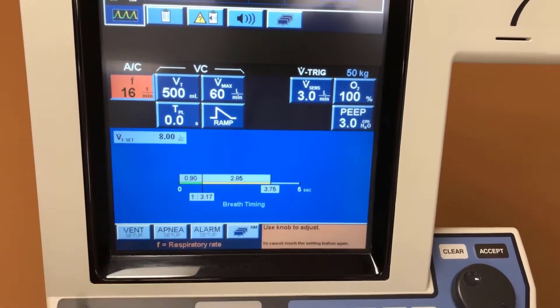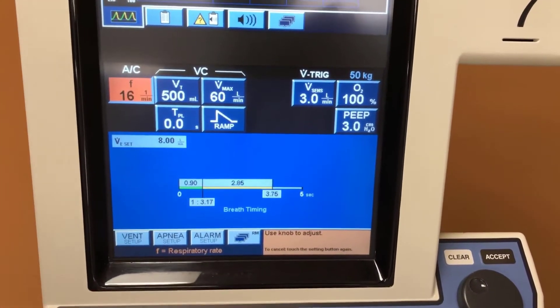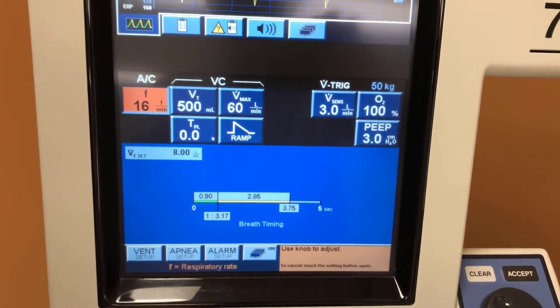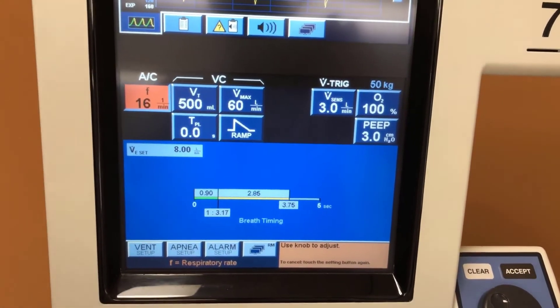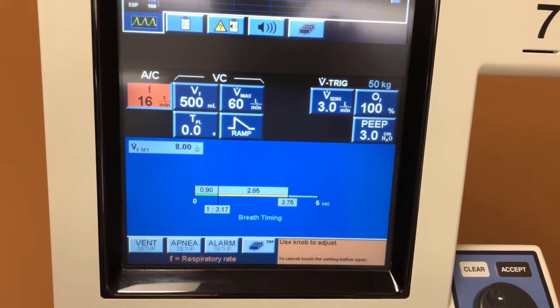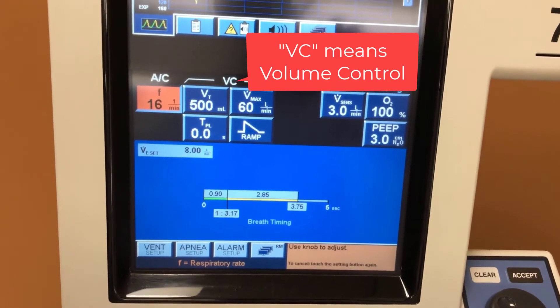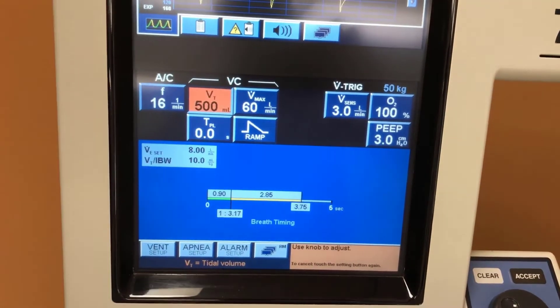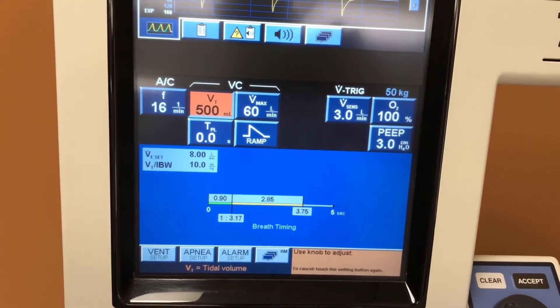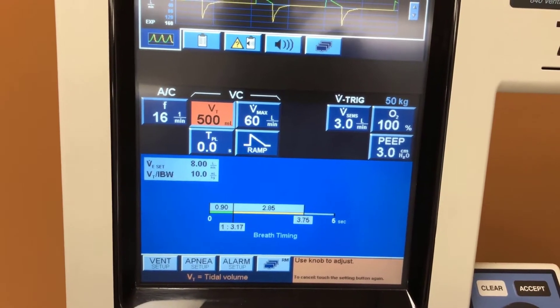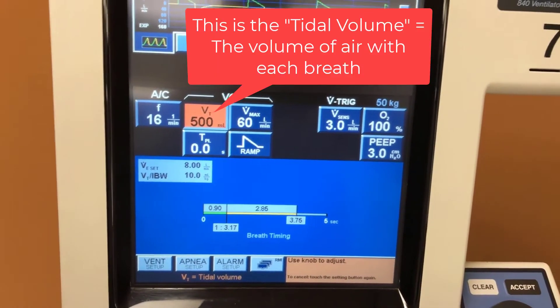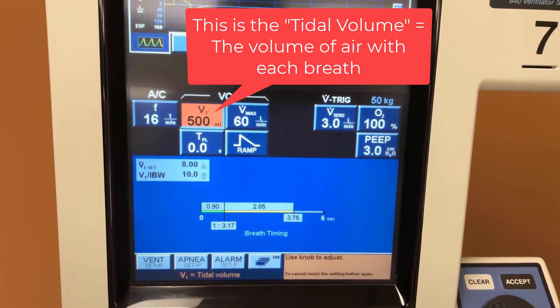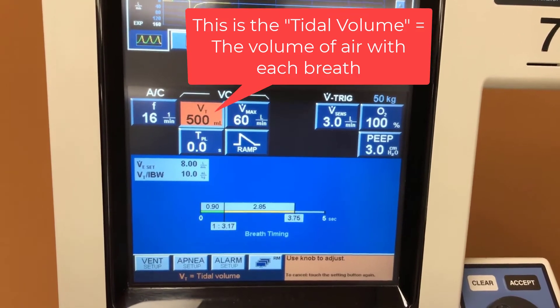The first number over here is the frequency, or respiratory rate, and the machine will be generating 16 breaths per minute. Within each breath it will be delivering 500 milliliters, and this is the tidal volume.